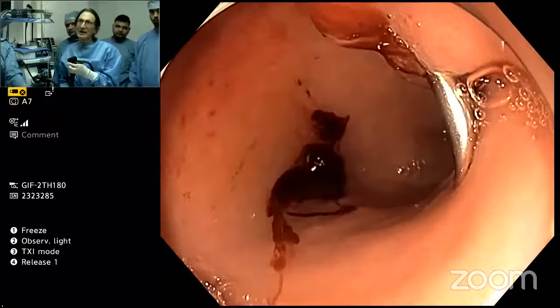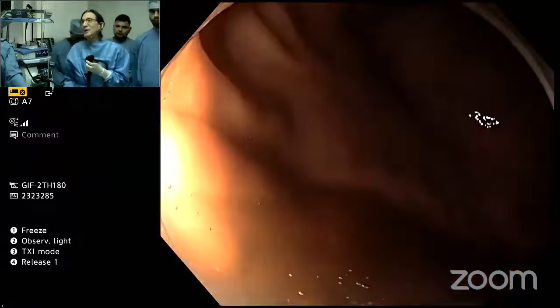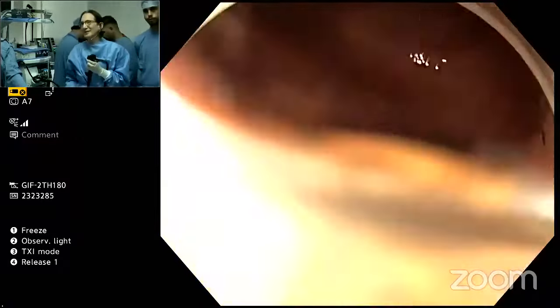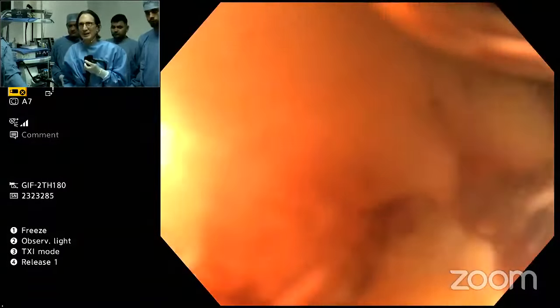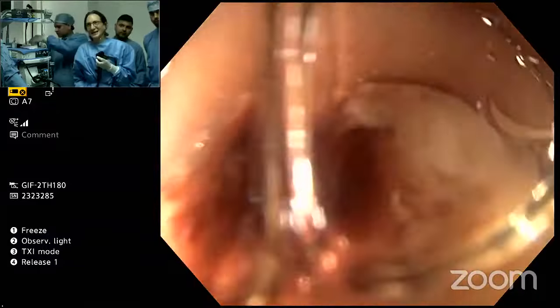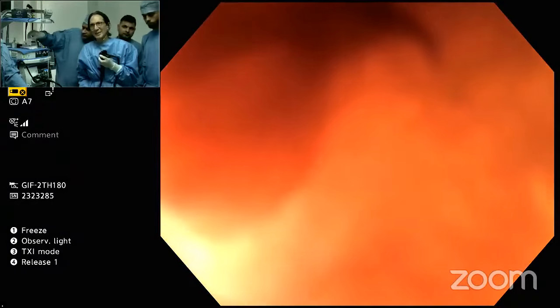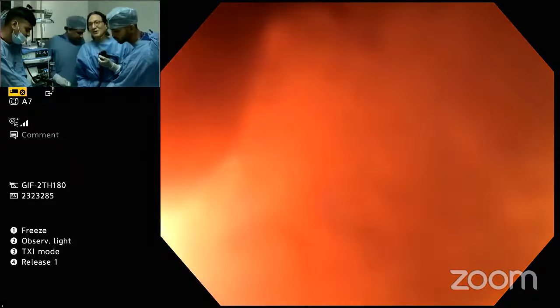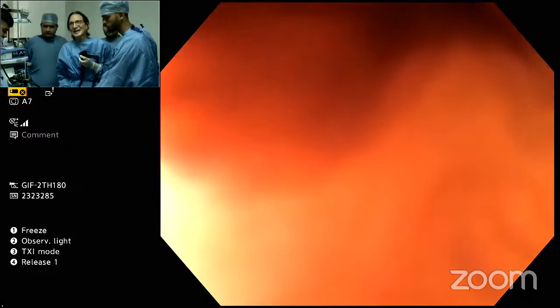So there it is. And now I just get my specimen, and I'll put my money on this, that it's a lipoma. So we'll just suck that up into the cap. Hopefully it'll come. Otherwise we have to get a Roth net, but I'll just slowly pull this out. Thank you, Professor. Right, it's coming. Often you lose it right at the cricopharynx. One time it actually fell down in the trachea, so we don't want that to happen.